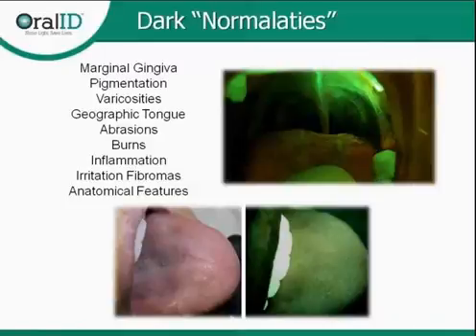pink bacterial growth on their teeth. And then once you've cleaned them, you can show them again the difference. And so like I said, it's like using disclosing solution but without having to deal with the mess. Or if you see adolescents, it could be an extra kind of step that you do that they think is kind of cool.